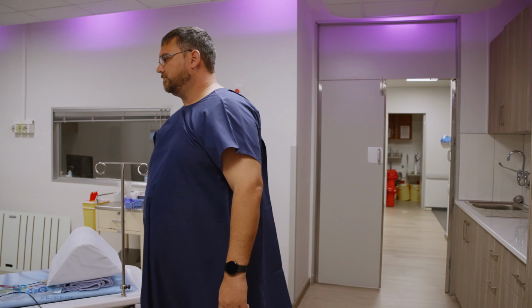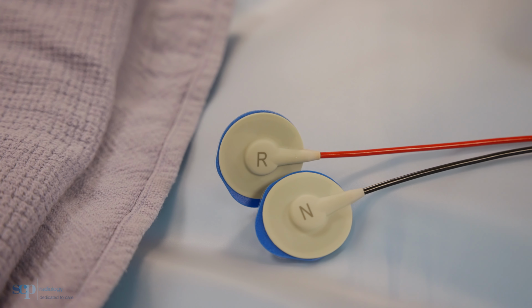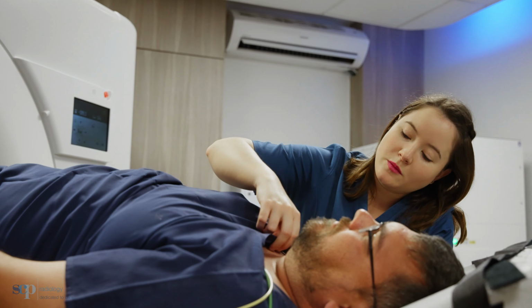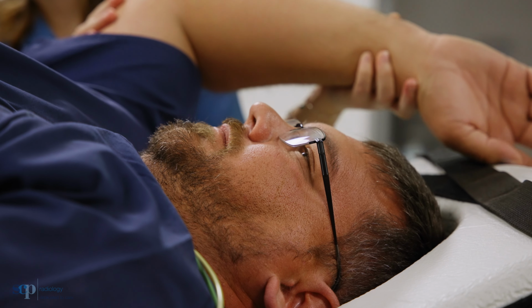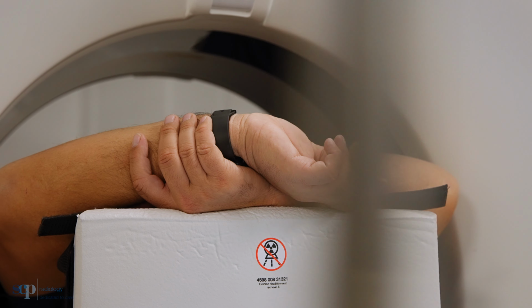We'll lie you down on the bed. We place the ECG stickers on your chest and we connect it to the CT scanner. So we're going to first do a calcium score through your heart. What this does is see if you have any plaque sitting in the arteries. If you have a nice low plaque count or 0, then we will proceed with the angiogram.